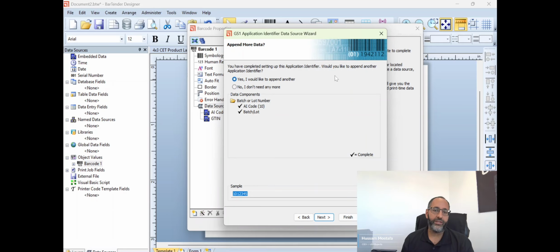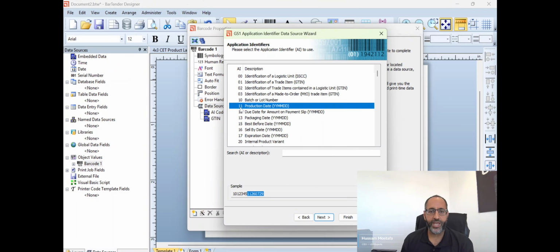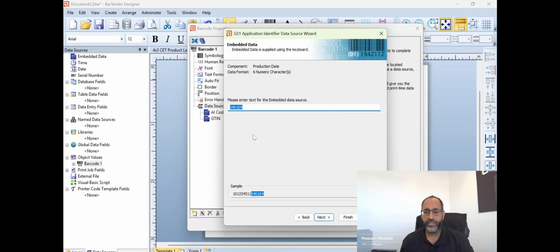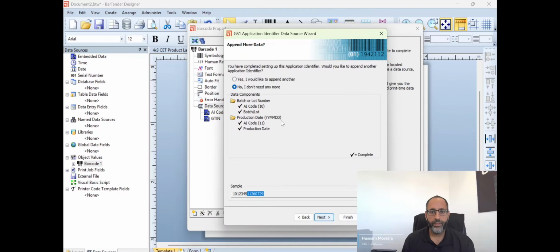And then let's say, for example, we want to add in the production date when we manufacture this device. So I'll just go ahead and say yes, I want to add some more in there and click Next. And so now we go to the production date, which has an application identifier of 11. We'll go ahead and click Next. As it shows, the date format has to be in YY for the year, MM for the month, and then DD for the day. So we'll click Next, Next, and we'll do embedded data so we can enter the data in there. Today's date is July 29th, 2026. So we'll go ahead and put 26 for the year, and then for the month we'll put July. And then for the day, we'll put 29 and click Next. All right, I think we added enough in there, enough data regarding the device identifier and the production identifier. So we'll go ahead and click Finish.